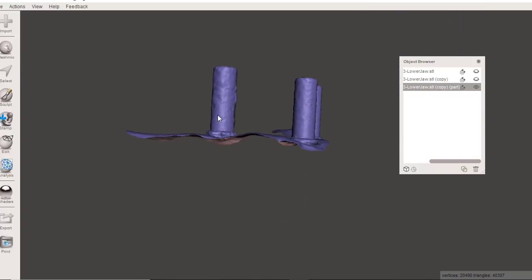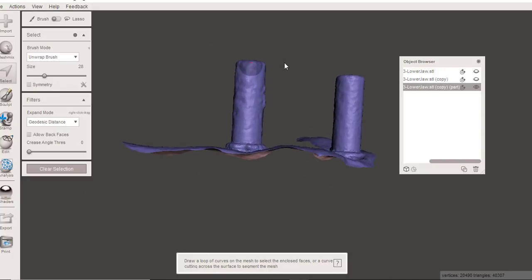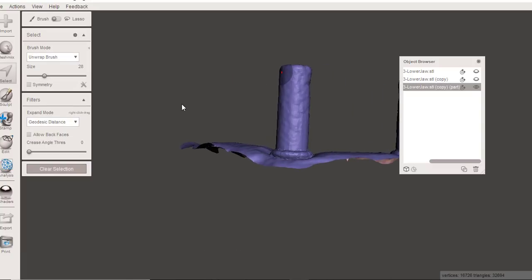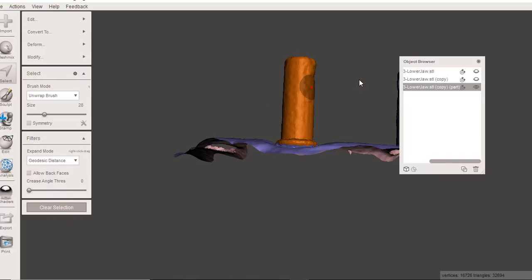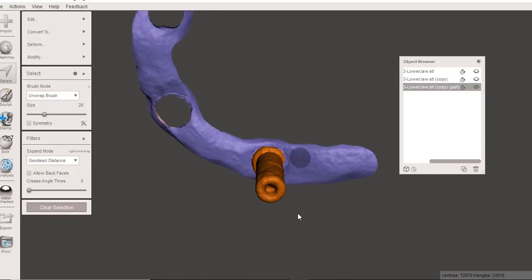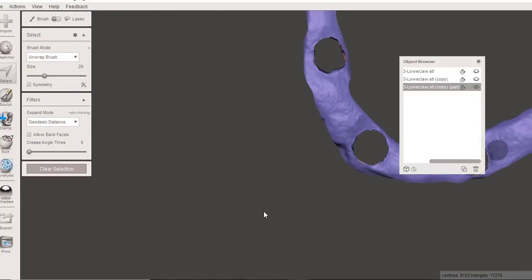So now that I've got that, I want to subtract out my cylinders. So what I'm going to do is use the select tool, and if you start it from somewhere out in this gray area and then circle, it just turns into a lasso tool. So if I click over here, I'm going to encircle this and delete it. And if you catch a little extra there, shift, undo that selection. Okay? And now we've got that.